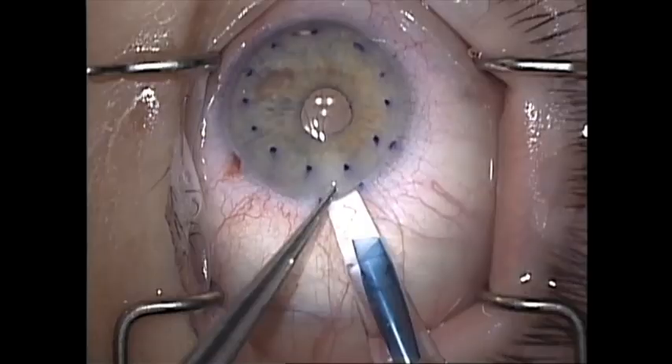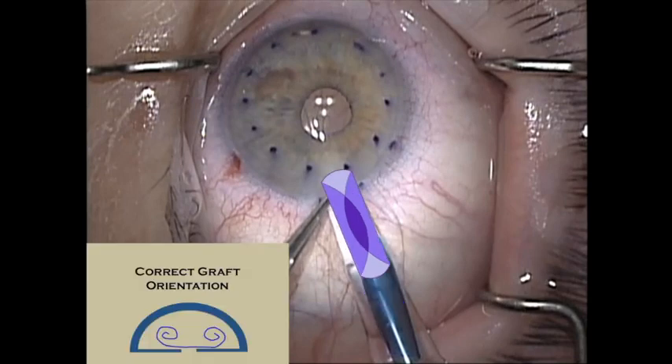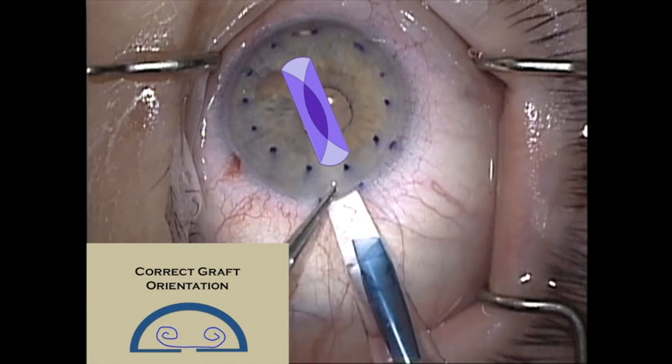I like to advance the graft so that it is near the tip and ready to inject. I also observe the orientation of the graft so that I optimize my chances of injecting the graft right side up, which makes the case much easier. What you want to see is that the V-shape is anterior in the tube, and once the graft is injected into the anterior chamber it should be in the correct graft orientation, which minimizes the manipulation needed later in the case. If the V-shape is not found to be anterior, the Jones tube is simply rotated within the incision until the graft is right side up, and it is then carefully injected into the anterior chamber.